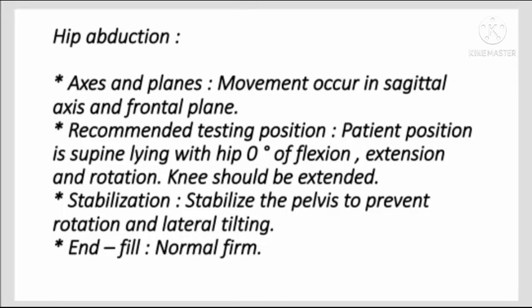Hip abduction. Axis and planes. Movement occur in sagittal axis and frontal plane. Recommended testing position.